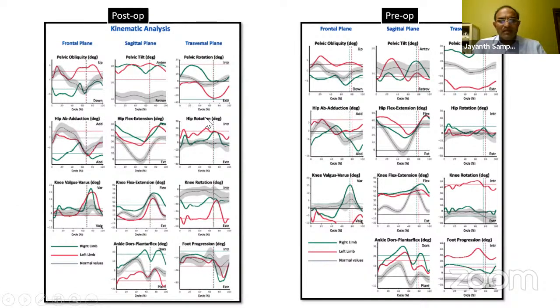And you can see that the hip again is more towards normal, and then the foot progression angle is within ideal limits. In the sagittal plane, I think I have over-released her left hamstring. So you can see that there is a little bit of recurvatum on the left side in mid stance, and I have slightly underdone the hamstrings on the right side, which is perhaps absolutely the correct amount of hamstring release. But in practice, these are very difficult to judge. So those are the improvements that have been produced by the surgery.